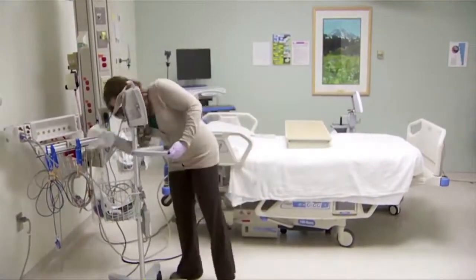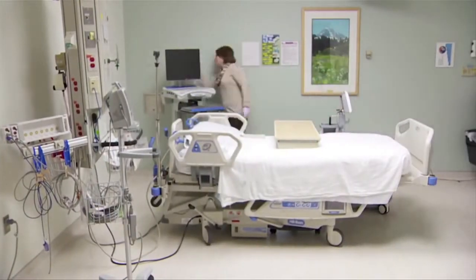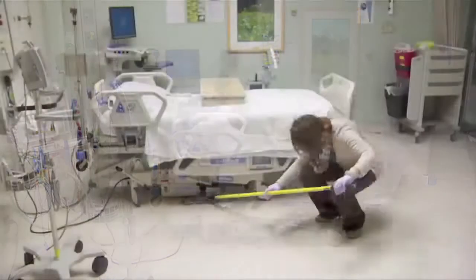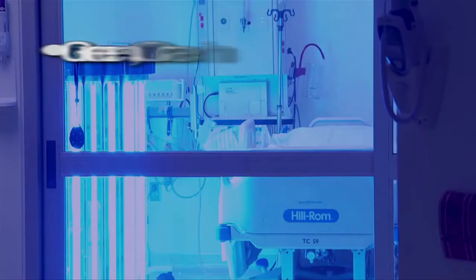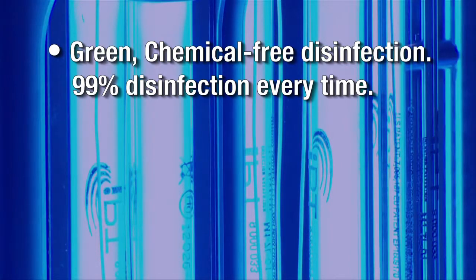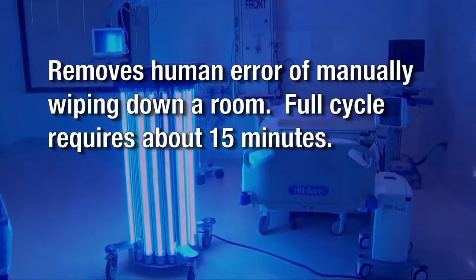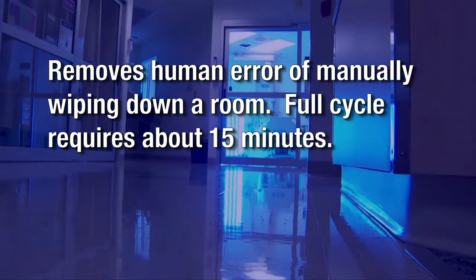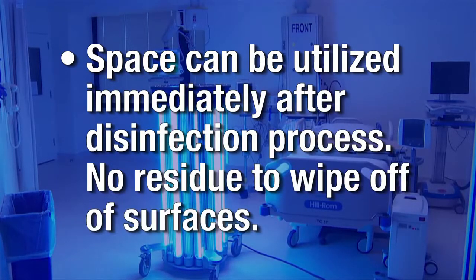One hospital housekeeper typically cleans an ICU room. It takes roughly 45 minutes to an hour, depending on the size of the room — getting all of those little crevices like the keys on a keyboard, under the bed, dusting high above and then mopping the floor. IRIS can clean a room in one quarter of the time using green, chemical-free disinfection. There is 99% disinfection every time and IRIS removes the human error of manually wiping down a room. The full cycle requires about 15 minutes, and the space can be utilized immediately after the disinfection process with no residue to wipe off the surfaces.